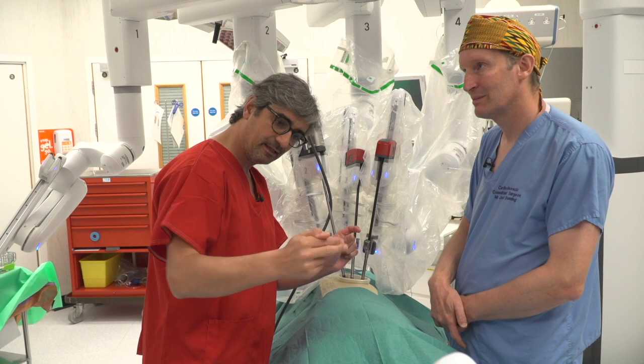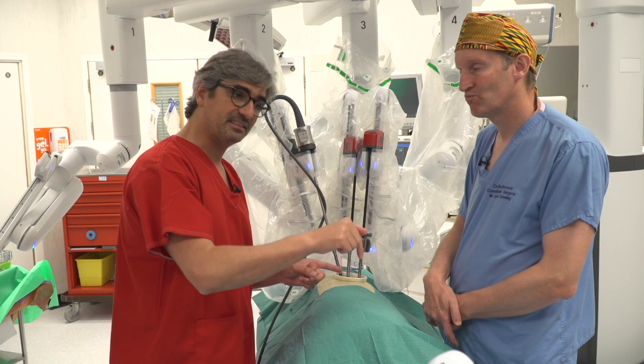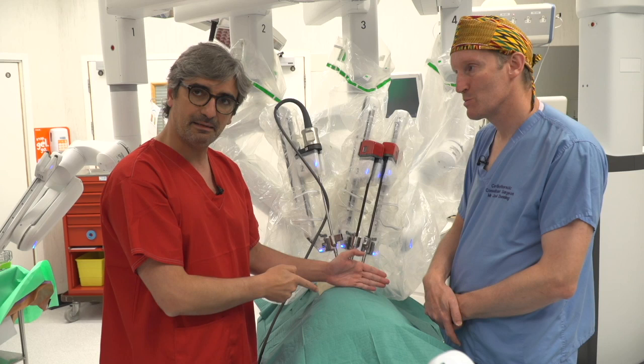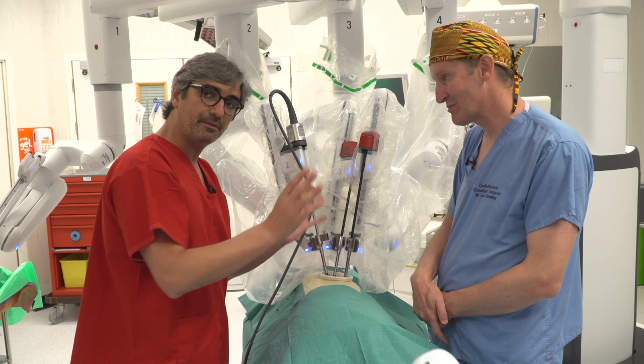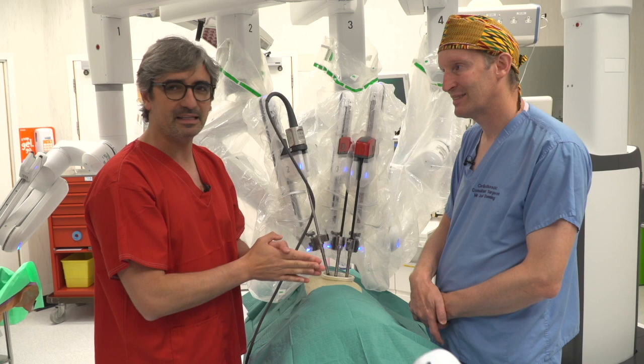Otherwise, if you try to put the staplers through the 5th intercostal space for robotic lobectomy, then when you put a stapler in, you are limited, completely blocked. You cannot rotate the stapler, so it's not good. So putting the robot incision lower, at the level of the 7th, you don't have problems reaching the apex because the robot is designed for this purpose. And this is why it's so good. And then you will do everything with no problem. You don't feel that you are in the 7th intercostal space. Of course, if you are doing uniportal VATS and you are in the 7th, it will be extremely difficult to do an upper lobectomy because you will be too low for VATS, but not for robot.